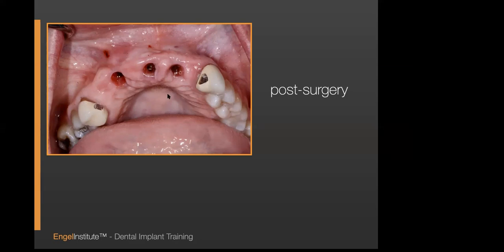Punch case, no flap, no incision, no sutures. This case for me in my office is no more than 20, 25 minutes. For you guys, add an extra 10 at the beginning if you're new at it. But this is easier than a 2-surface composite for the person who knows how to execute this procedure, including you guys. If I'm having surgery, I want it done this way.